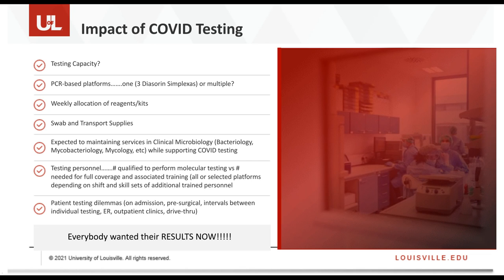And based upon that particular discussion, we had decided we needed to increase primarily processors, not necessarily medical technologists, but we did bring on 3 or 4 additional processors who also were trained to load the Kiestra system. And with the automation provided by the Kiestra, these people were relatively free, or had more freedom, to access, log in, and deliver the COVID specimens to the molecular diagnostics laboratory.